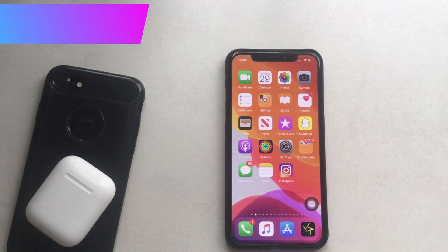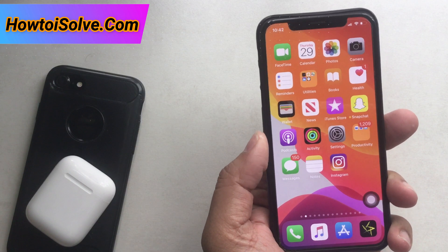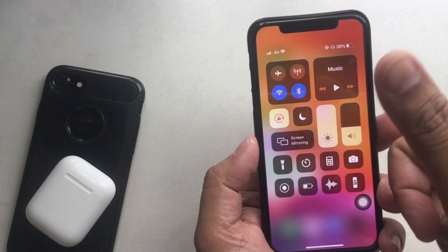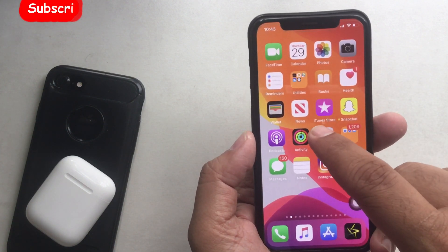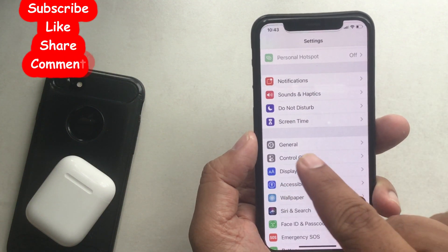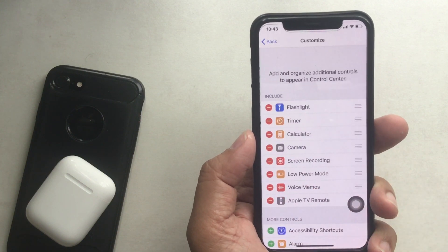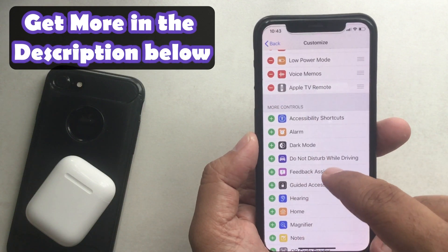Let's get started setting up LiveListen with your Apple AirPods or Powerbeats Pro. First, we need to add the hearing button to the control panel, which is not added yet as you can see on my phone screen. To do that, open the Settings app and access Control Center. Tap Control Center and choose Customize Control Center. Scroll down to find and tap the green plus icon next to Hearing to add it.